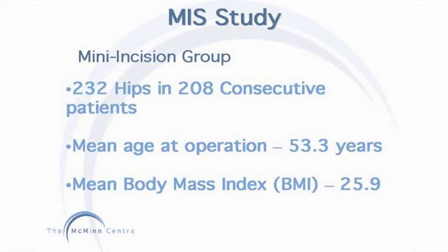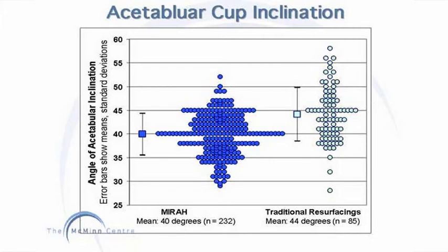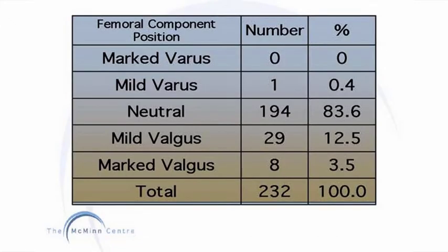A study was carried out to evaluate the technical differences and possible effects of the mini incision and the conventional approach. A consecutive series of patients who underwent a Birmingham hip resurfacing through a mini incision procedure in 2004 was analysed. The results were then compared with different cohorts of patients who had a Birmingham hip resurfacing through the traditional approach. These are the acetabular cup inclination angles for the two groups. The mean values for the two groups are within the target range, although the range of data is wider in the traditional approach group.